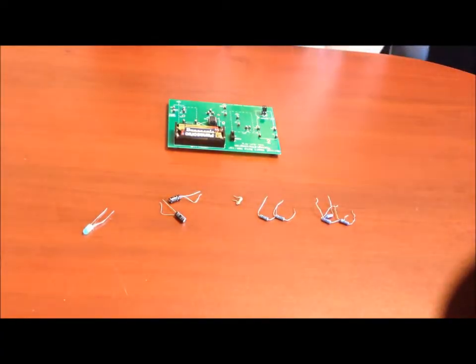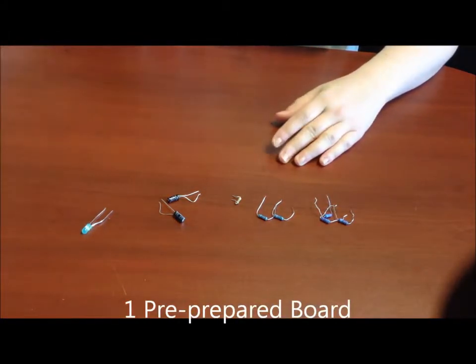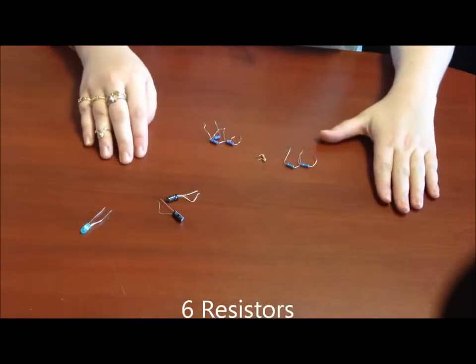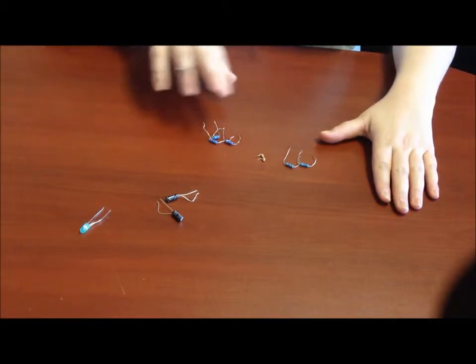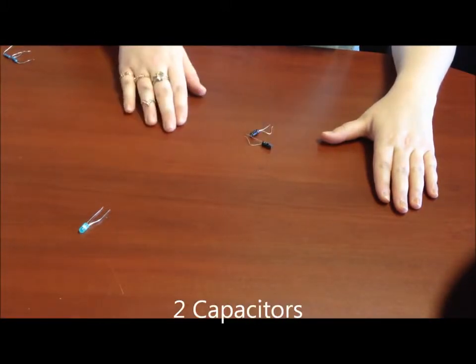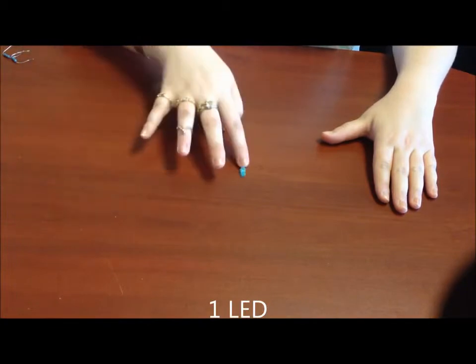Today we're going to make an optical heart rate monitor. We need a pre-prepared board, six resistors in three different sizes: three of this size, one of this size, and two of that size. Then we're going to need two capacitors and one LED.